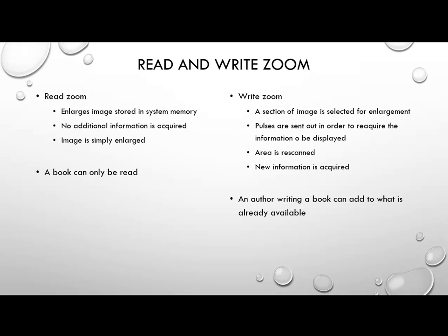Let's talk about a process known as the zoom. Zoom is, as you would imagine, just enlarging the picture in order to look at a section of it. Now, if we do that on a frozen image, we're going to call that a read zoom. This enlarges the image stored in system memory. There's no extra information acquired. The image is just simply made bigger. May not be better, just simply made bigger.